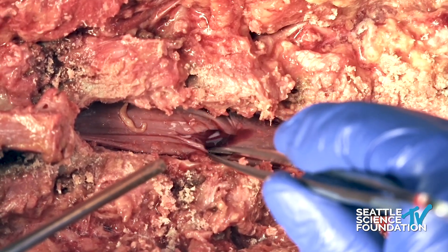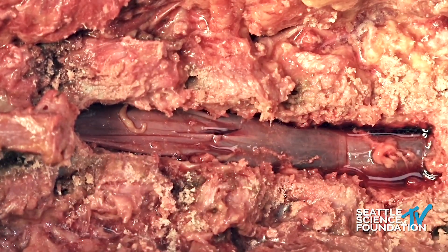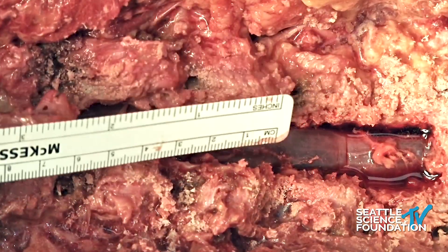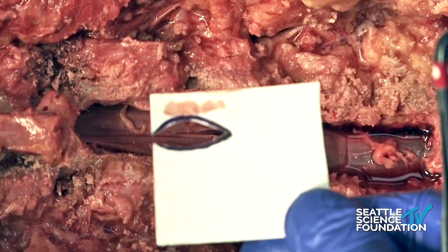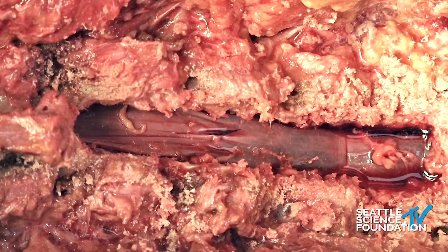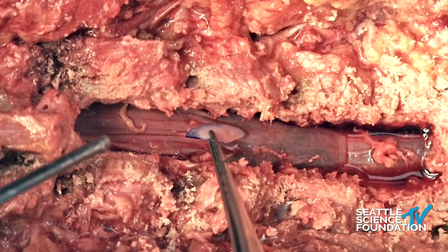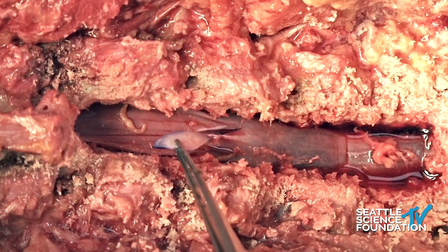For the purposes of this lab, we are going to be repairing this durotomy with a patch graft. There are many different types of patch grafts that one can use, including cadaveric skin or bovine pericardium. What we've done here is we have a dural substitute graft. First we use a ruler to measure out the dimensions of this durotomy so we can cut an appropriately sized patch of dura. We've soaked that dural patch in saline so that we can now start repairing.